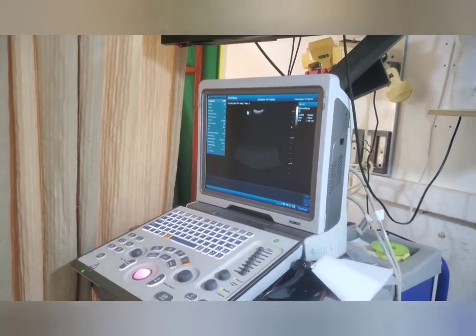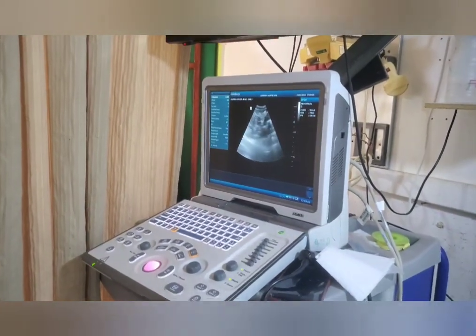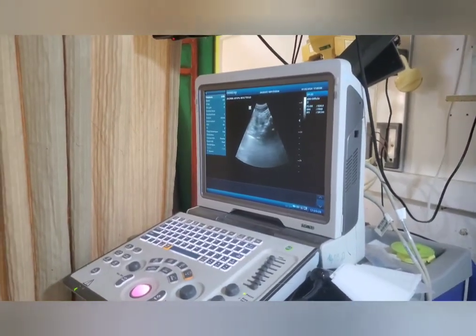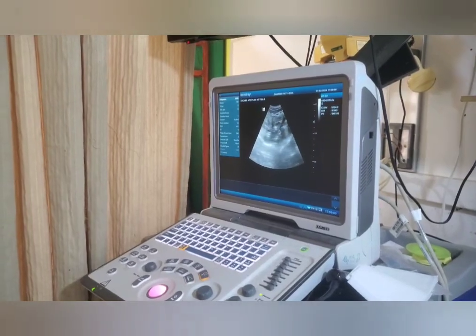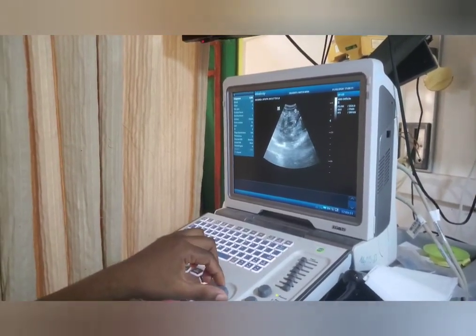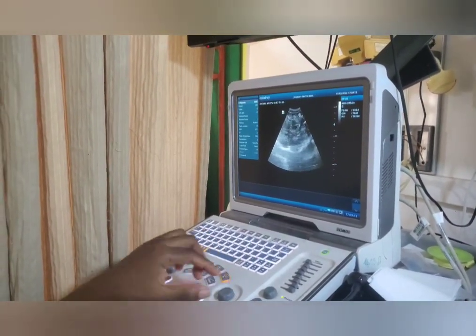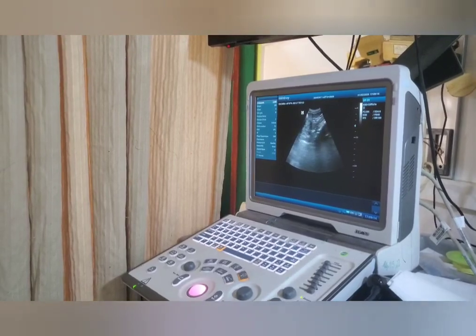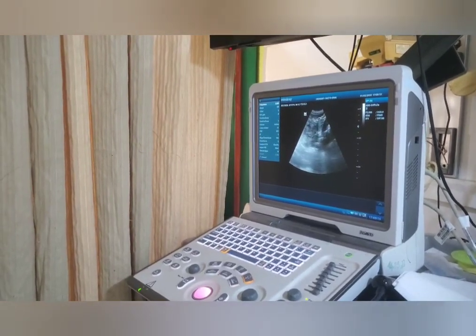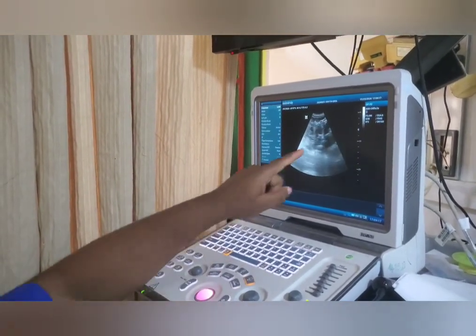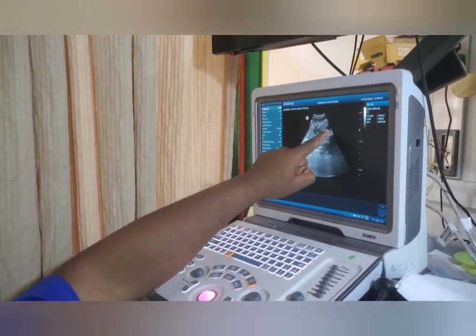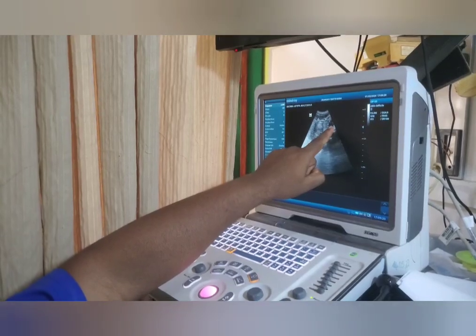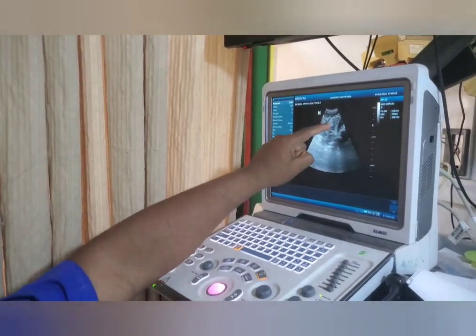That is for the transverse section of the spleen. Now for the longitudinal section of the spleen, you try to span to visualize, and we do the gain compensation. You visualize the spleen, and this structure upward here is the stomach, which is hypodense.